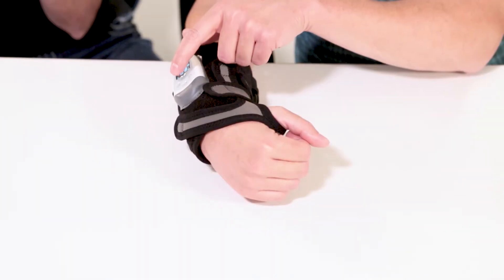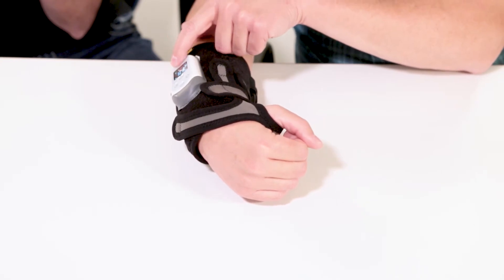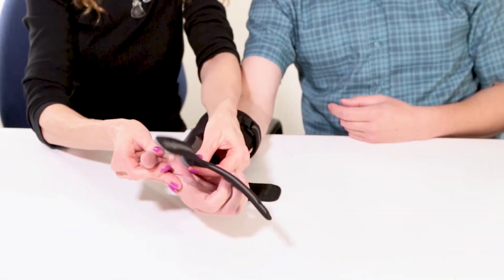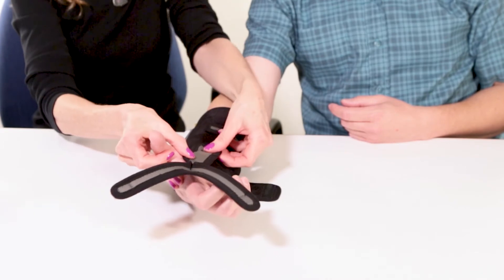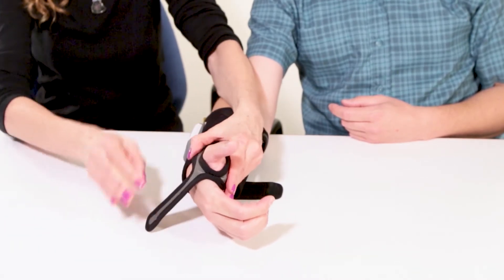If flexion of the end joint of the thumb is desired, the included thumb strap allows the placement of the small thumb electrode directly on the fleshy ball of the thumb. This is where the thumb flexing muscles are located.